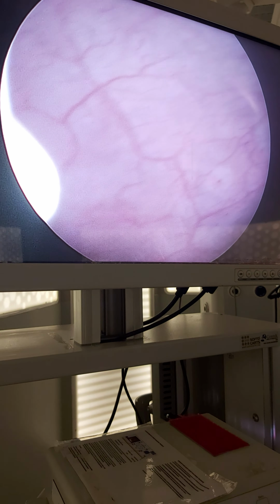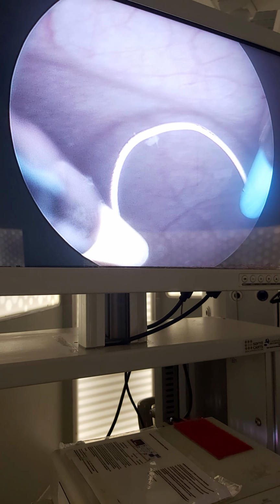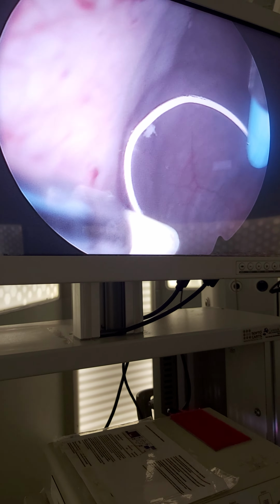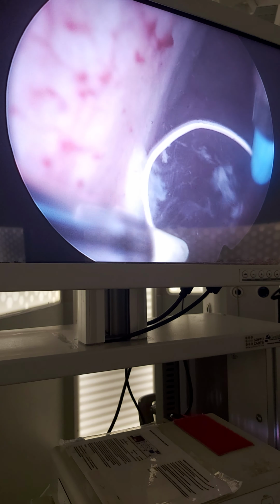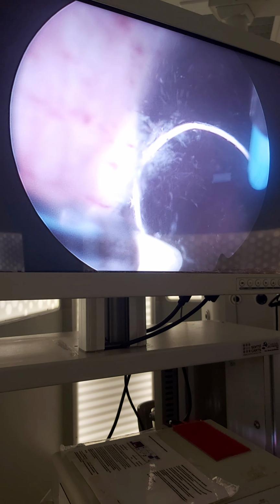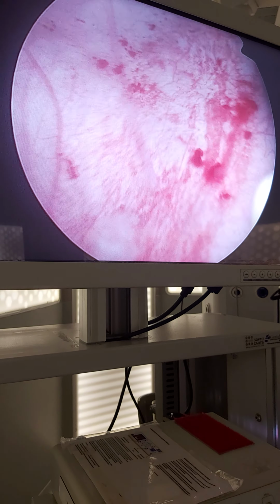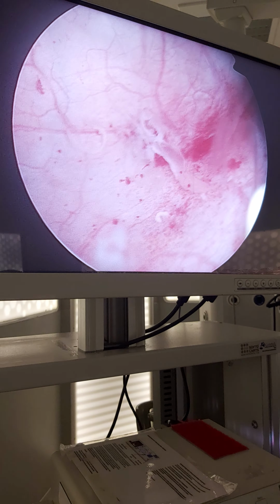So these are all my experience. I will not do it here. This is the normal mucosa, but here the bladder has bled. I know it's not harmful just with my experience.